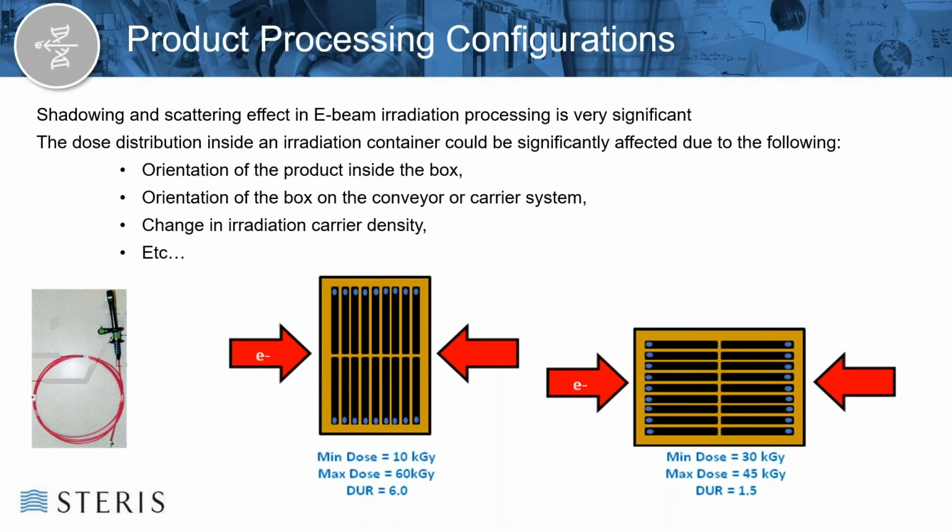As you might be able to picture, there's a number of ways you could orient that product in the carton, and how those product units might stack. Now, if all those handles are all stacked in a row and you radiate through that stack, you're trying to penetrate a very dense area of the product. And that really dense area is really going to drive what your total dose uniformity within your volume is.